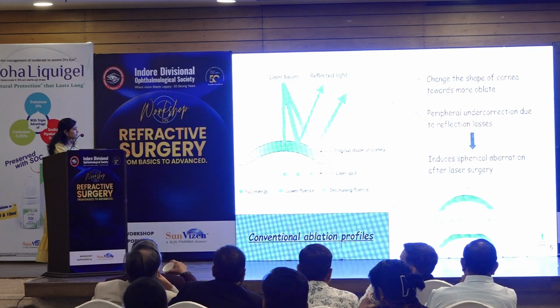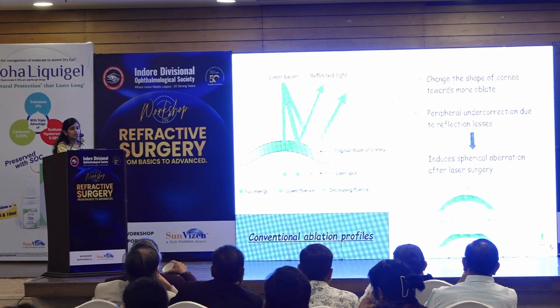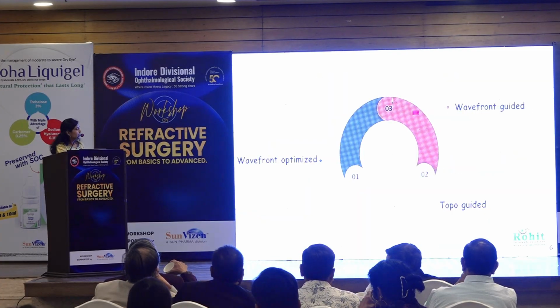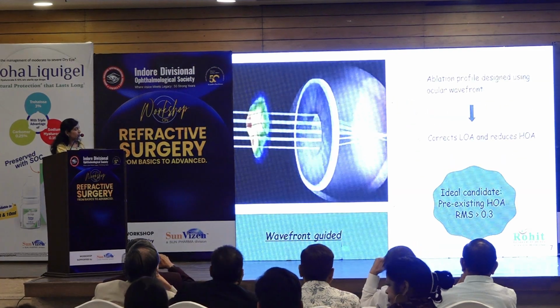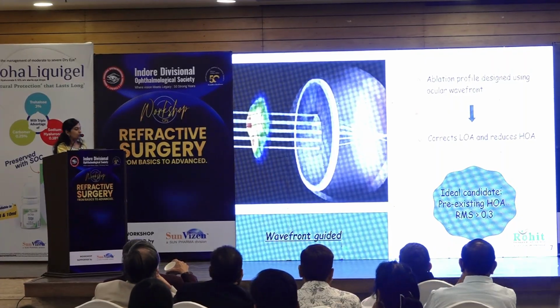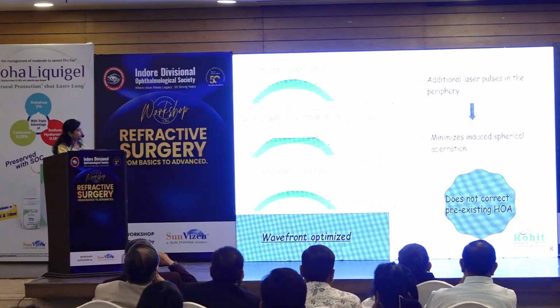The standard LASIK or the conventional ablation profiles used to induce a lot of spherical aberration post-surgery, which resulted in visual problems, especially the night vision problems in the form of glare and halo. Then came technologies like wavefront guided, which were designed to correct all the aberrations of the eye, but an ideal candidate was one with higher order aberrations more than 0.3.